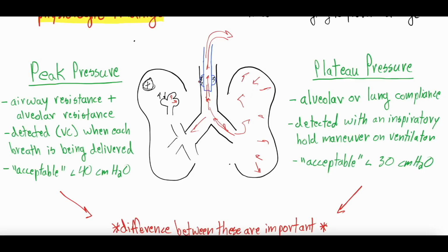So when we're evaluating a patient on the ventilator, let's just say you're prepping for rounds in the morning to present the patient to the attending intensivist, there's two pressures that we're interested in, right? The first is the peak pressure, and the second is the plateau pressure.